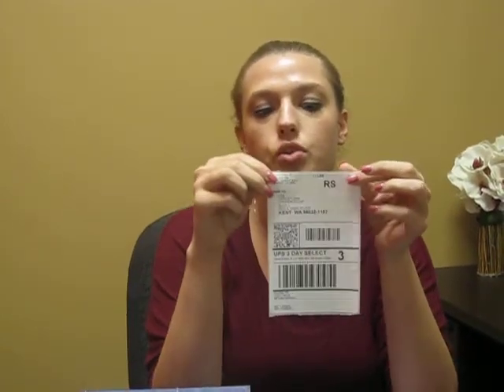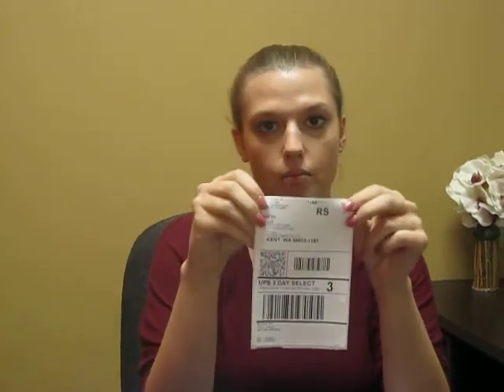The only thing is, if you do put this on the box and say you forgot a vial, you will be paying for it out of pocket to be sending it to the lab. And I believe these are like $13 to $15, I'm not sure. So just make sure you have everything back in the box before you send it out. Like I tell all my patients, what is in the box goes out of the box. So you're going to send everything that is in this box out, except for this. This is going to go on top.